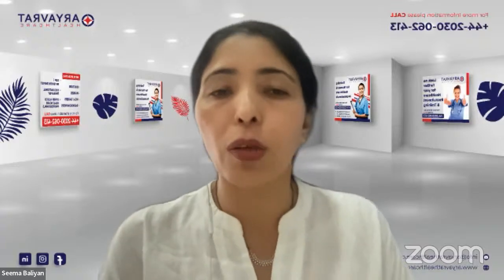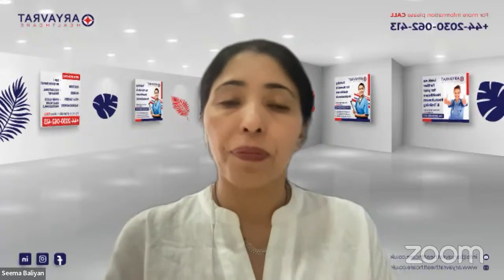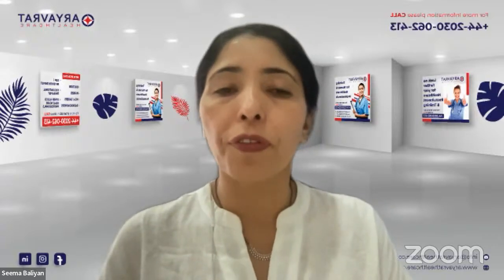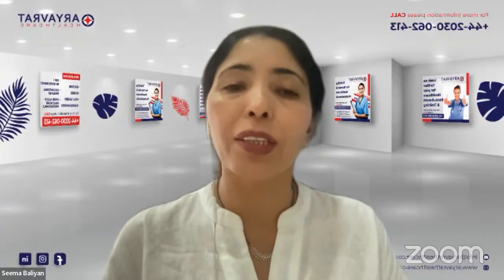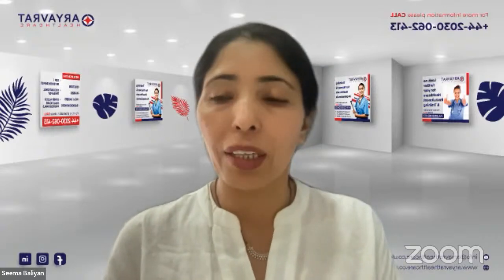Okay. Another important thing is to make sure that you tell the patient that they should not share the inhalers or the spacer. It is for their own use, and they should be aware of the expiry date, as well as that they should have a spare inhaler just in case they run out of the medication.